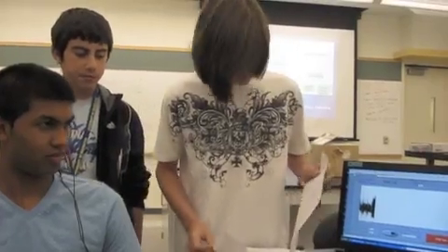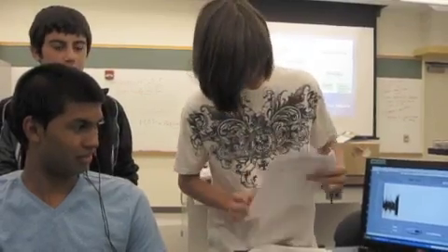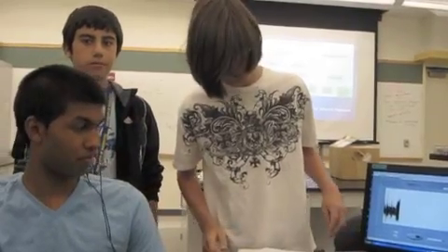Alright, so this is Nick, Paul, David, and the Dr. House Biomedical Engineering thing at the University of Rochester Summer School program. And I'm here to talk to you about introducing EMG. EMG stands for electromyogram. It is a graphical recording of electrical activity within muscles.